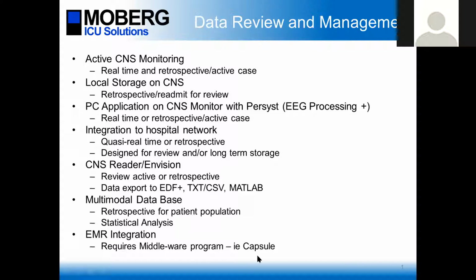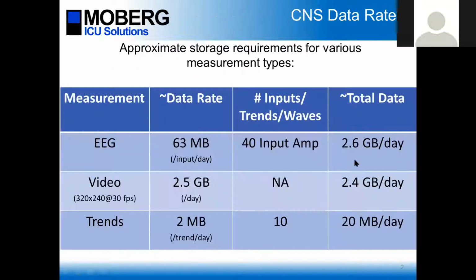So I want to show you, I'm going to minimize this screen here. If I can get to my minimize button. Whoops, where did it go? Nope, we're going to go back one.